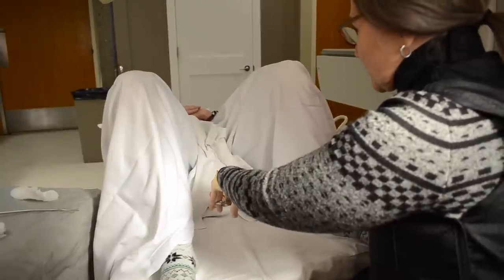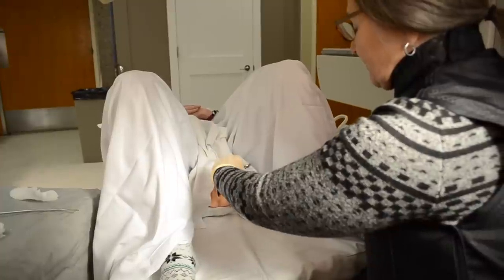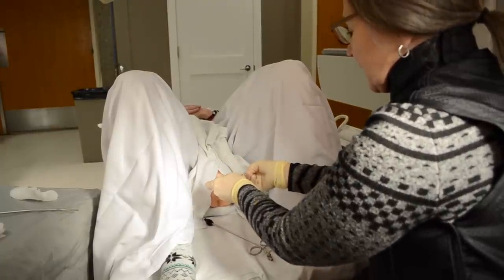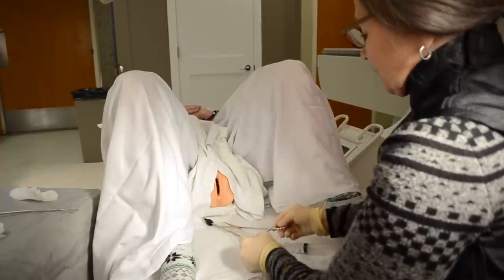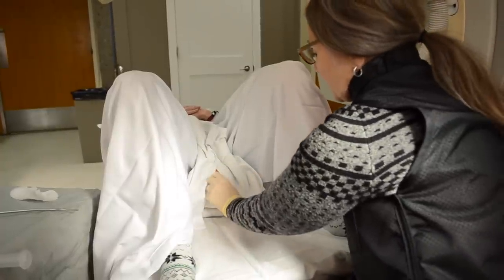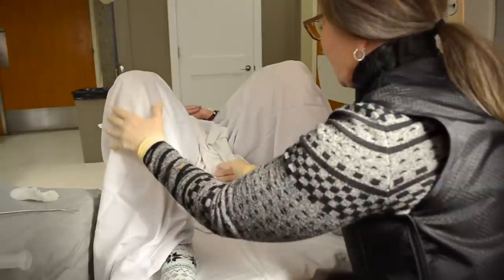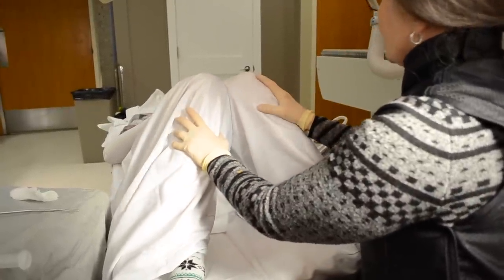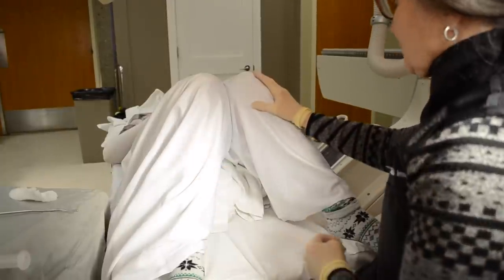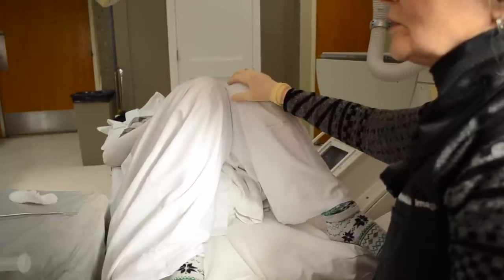Our images are great. The tubes appear to be open. I'm just going to remove my instruments now. First I'm going to remove the cannula and set it down. Now I'm going to undo the tenaculum, moving the tip side to side so I can remove it. I'm going to grab my leftover gauze and put it on your skin to collect any drips before you are able to get up and move. I need to thank you very much for not putting your hands on your tummy while we were taking pictures — had you done that, you would have taken really nice pictures of your fingers, but this way you've got really good images of your reproductive organs.